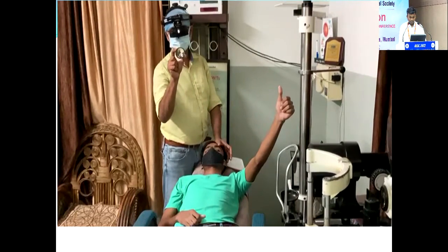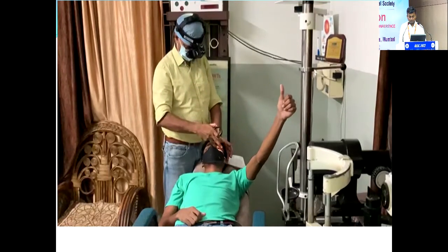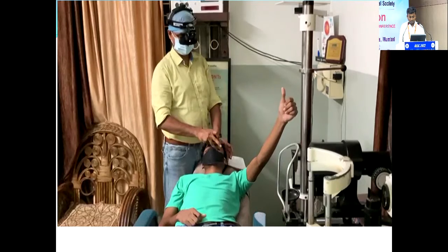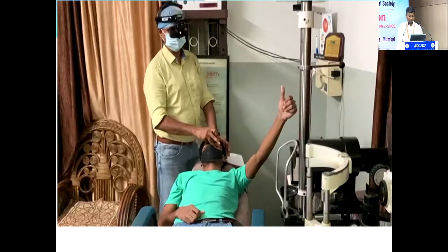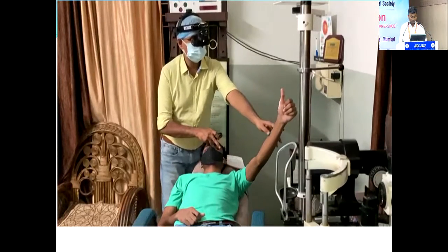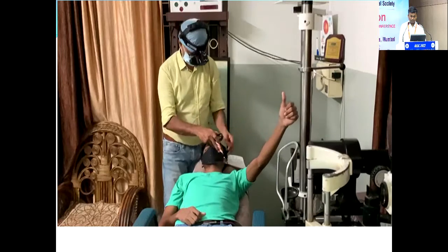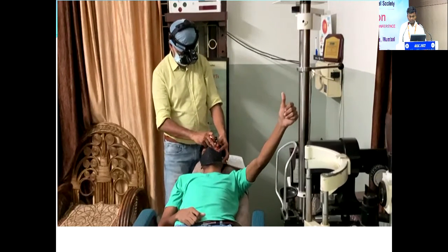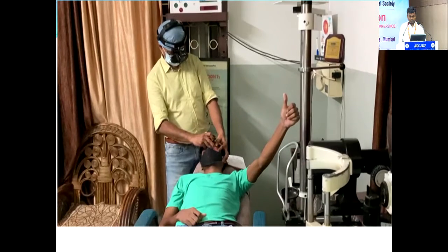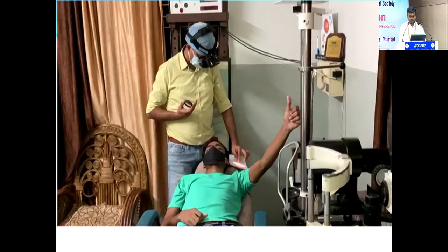You have to hold your lens like this, and this finger acts as a pivot or fulcrum. And with this you can move up and down, near to the eye and far away from the eye, for proper focusing. And you ask the patient to look in the desired direction. You just ask him to look at this finger, and then you focus on his eye. Now whatever you see near to you, you draw on this fundus picture.